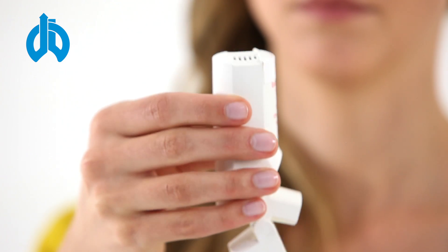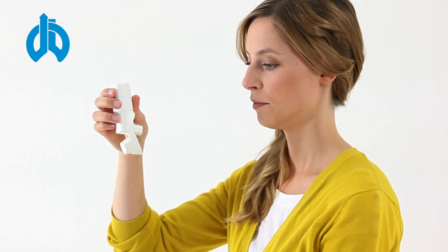Please breathe out slowly but not into the inhaler, and tilt your head back slightly.